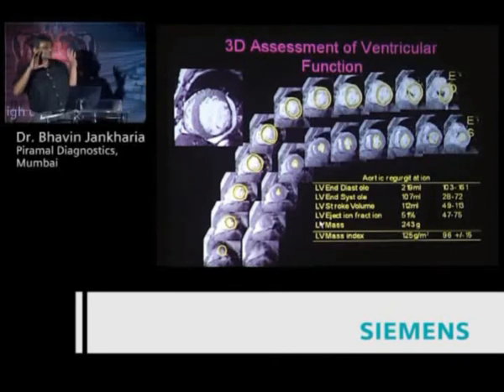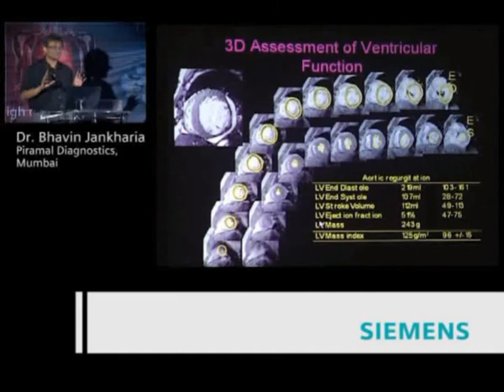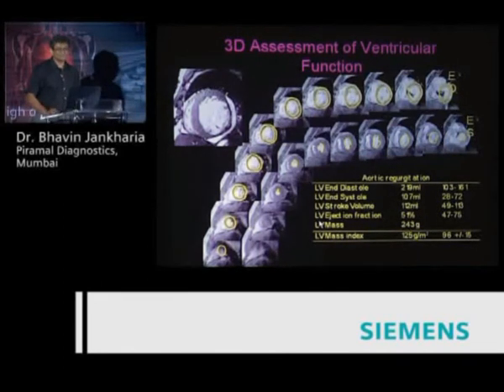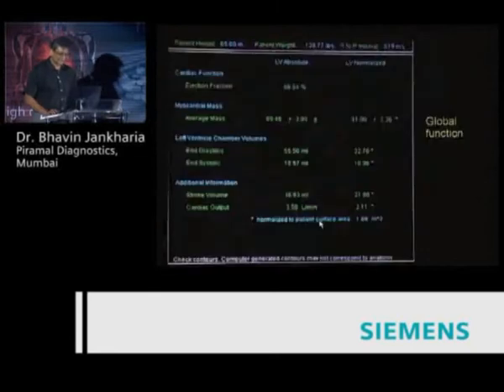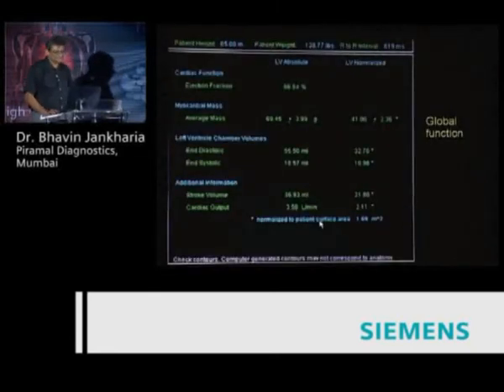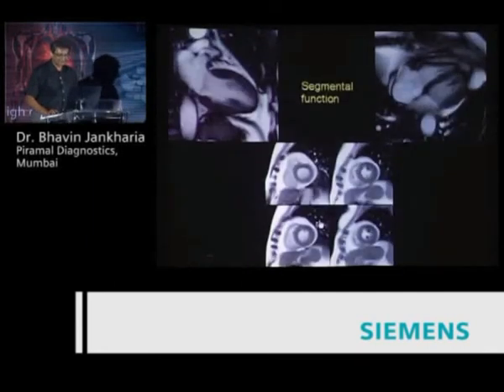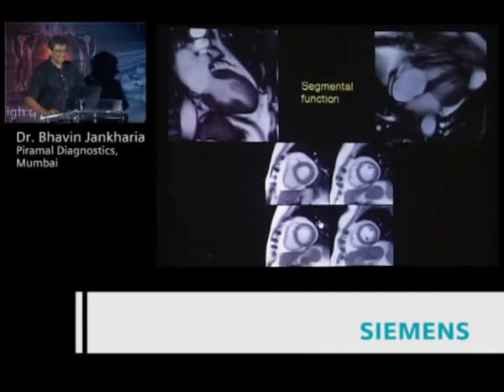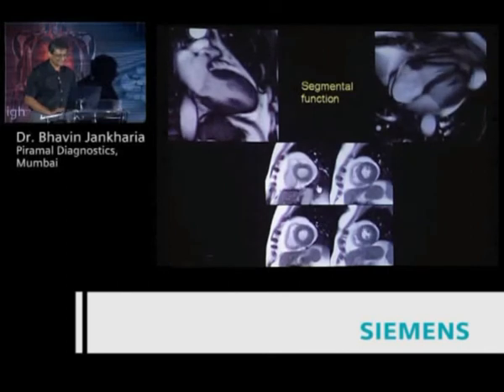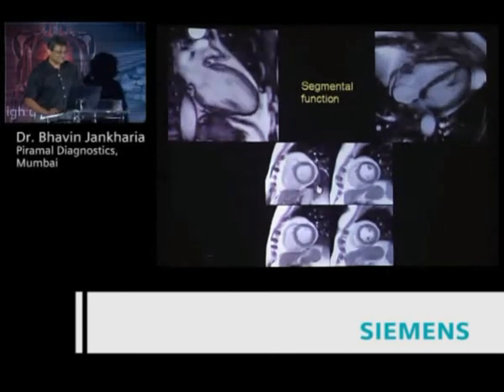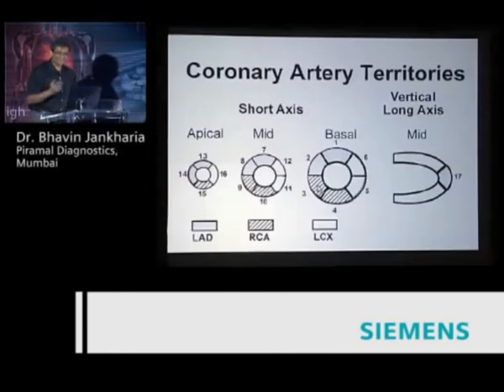Very rarely does anybody actually measure on echo — it's all eyeballing. We are much more accurate with MR, so let's stick with that. This is how we get the various values and report them. The next thing to do is segmental function, where we look at the short axis images. There is an AHA classification of 17 segments, and we should say which of these segments is contracting well and which is not.